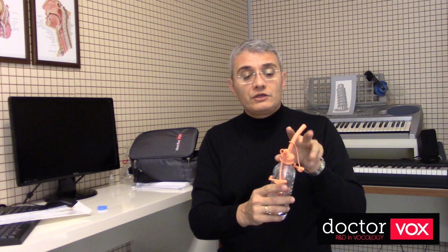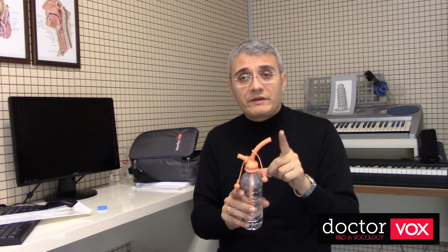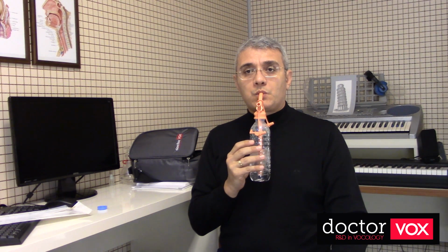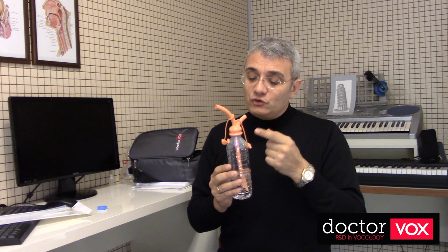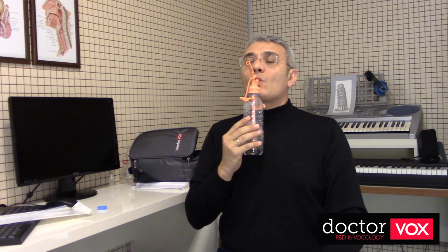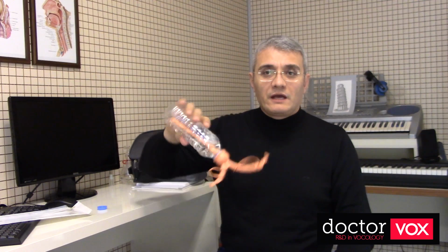For example, for children, you can cut it from the first line, for sopranos and tenors from the second, and for mezzos and baritones from the third. You do not cut if you are a bass or an alto. So you Lax Vox into the tube, you phonate into the tube like this, and if you want to humidify your vocal folds, you can inhale the humid air inside the bottle like this. When not in use, you can put the plugs on its place and water cannot be spilled out when you put the plugs inside.